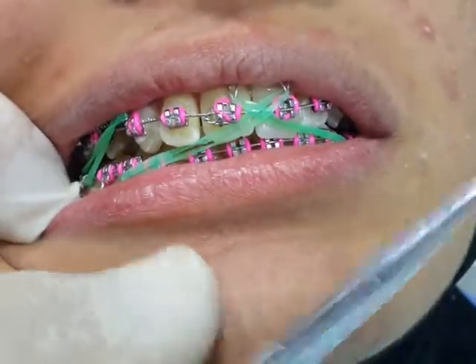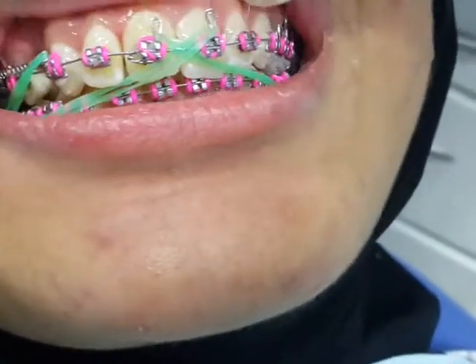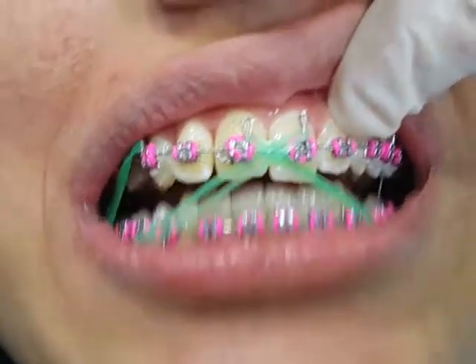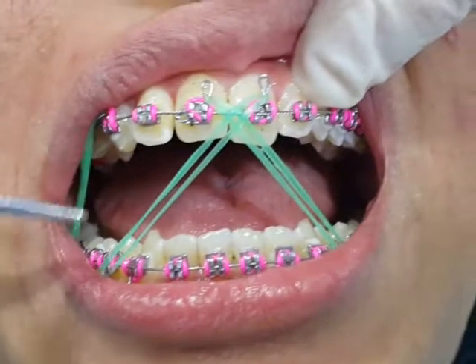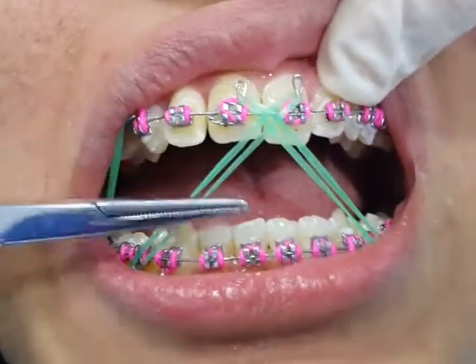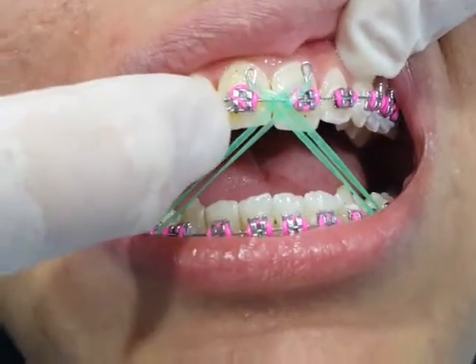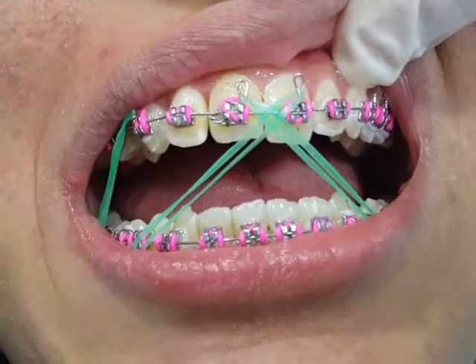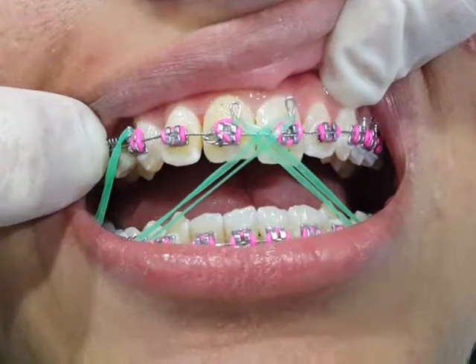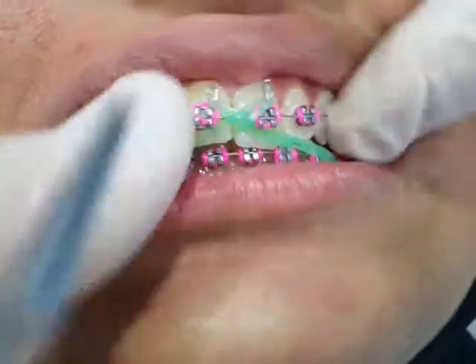After having one to two millimeters of space, we go immediately to the anterior section. I added a hook to the two central incisors, then I use a cross elastic between the central incisor and the first premolar. In this procedure, we are pushing the upper incisors backward, closing the space, and continuously obtaining new space from the distalization of the canine and the retraction of the upper incisors backward together.